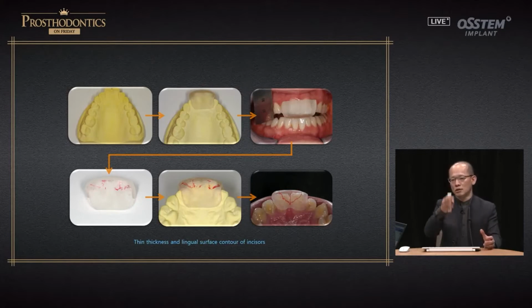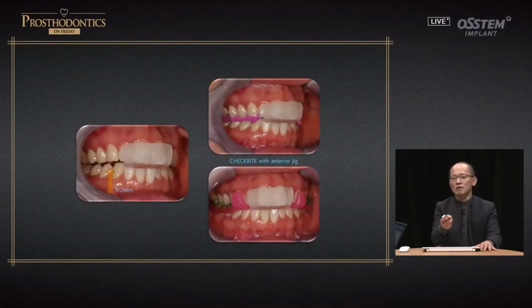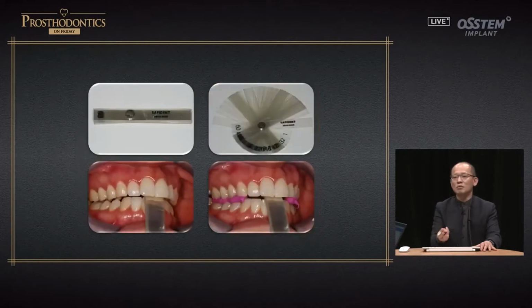And if you have such anterior and lateral movement, there is a cross line that comes into contact, and that gap is recorded. So you put something like that pink, and then on the posterior side, the masseter muscle comes into contact, and from the space, the TMJ goes to the anterior superior location. In other words, what is important is not to make it too thick. So using the space, you check the bite, and if you have the anterior teeth, using these tools is useful.